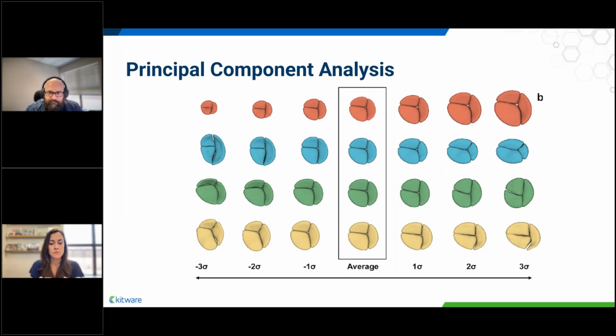So for this, we just ran our shape variation analyzer. And what we see here is we're displaying the average shape of these tricuspid valve representations and all of the different main axes of variation. So we see very clearly the first principal component is scale, which is a reasonable finding in a population of pediatric patients. But then interestingly, the second and subsequent principal components showed variation in the septal leaflet.